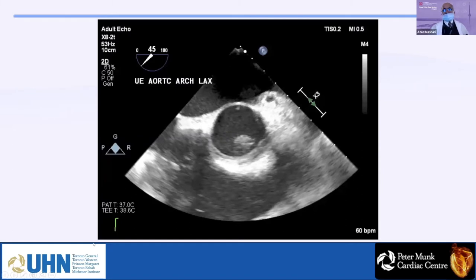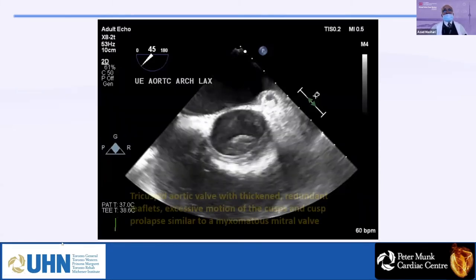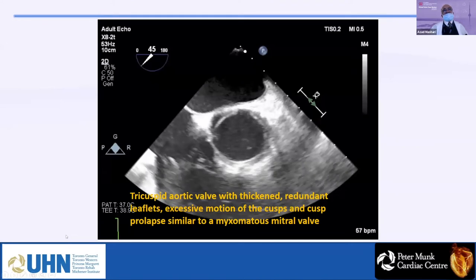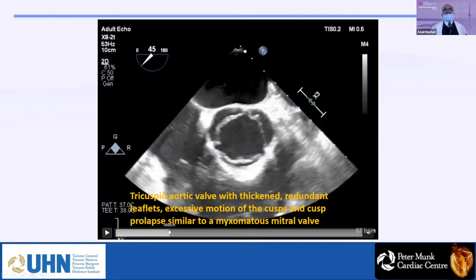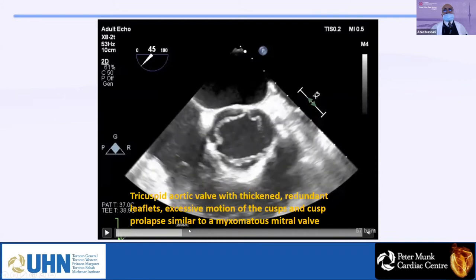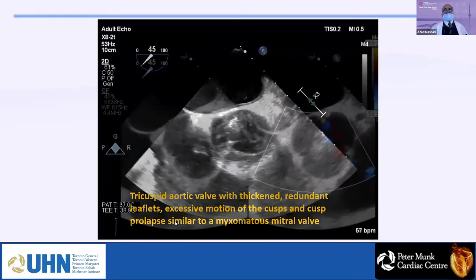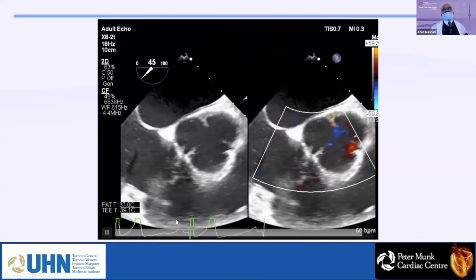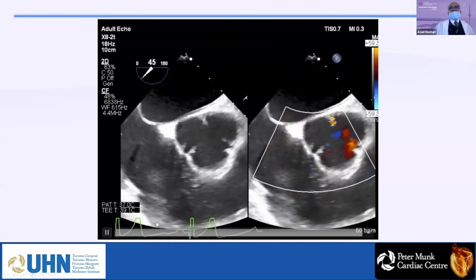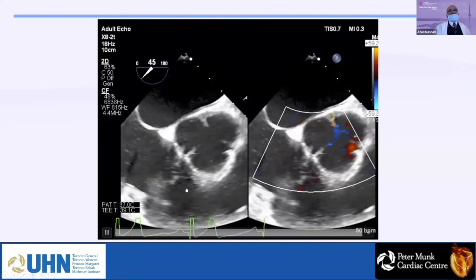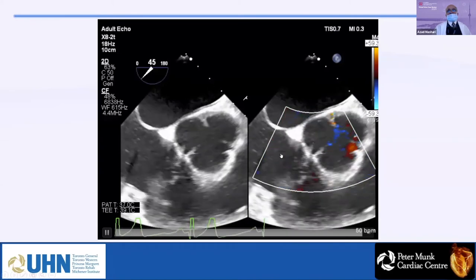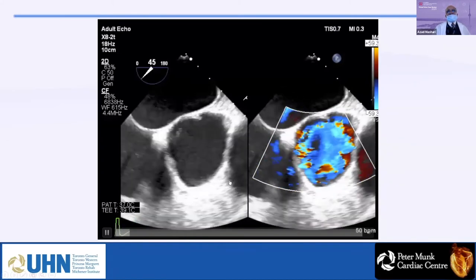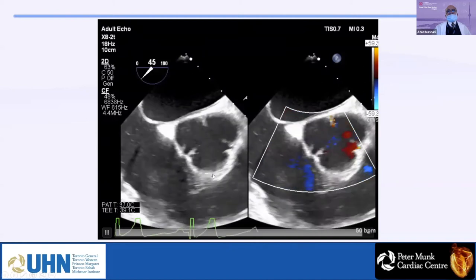When you see the valve, it is redundant and has extra tissue — similar to a mitral valve prolapse with extra tissue. In this view, you don't see the AI. I included it to show that sometimes when the probe is a little bit high, you might not see the AI in short axis at all. If you move the probe down maybe half a centimeter, you will see the AI better.